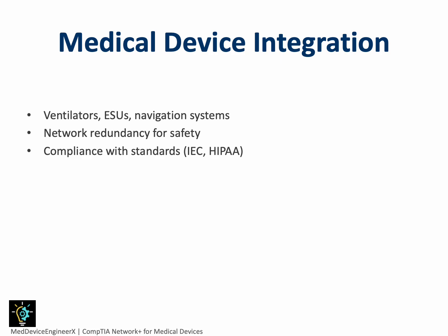Standards like IEC 80001 and compliance requirements like HIPAA add additional layers of responsibility, ensuring safety and data security. This integration highlights how distribution networks aren't just technical, they directly influence patient care quality. Biomedical engineers need to understand these principles to collaborate effectively with IT staff and ensure devices function as intended in a clinical environment.